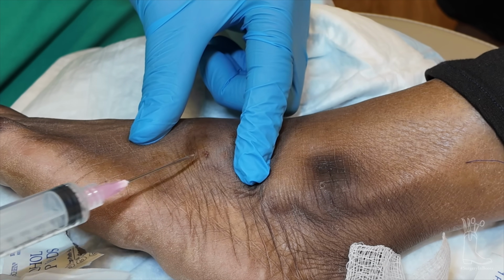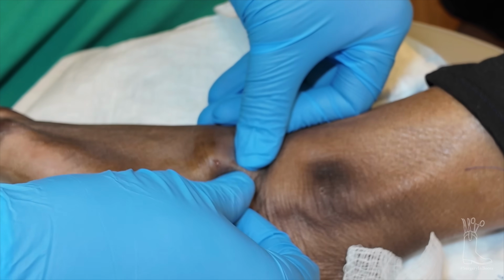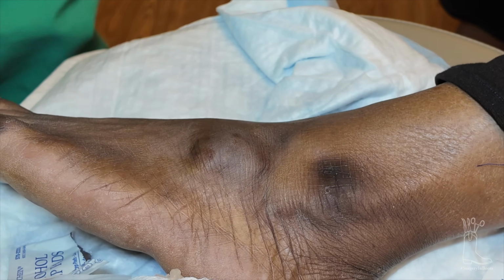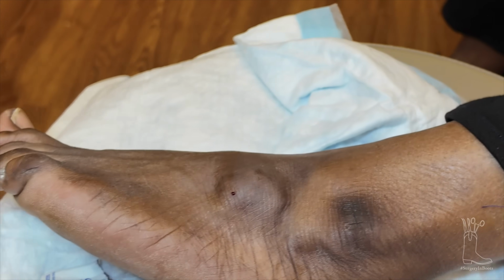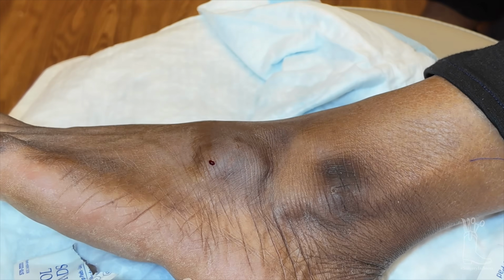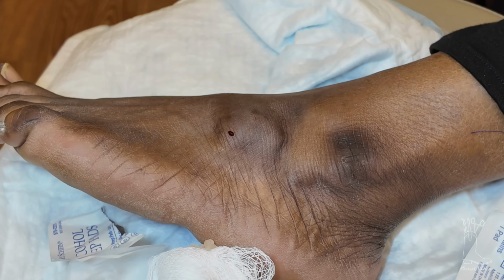Or is it too thick? It's too thick. Oh, let me be quiet because you trying to educate them. No, we educated everybody. You too. Hold on. Let me get a scalpel. Hey, Sally. Let me have 11 blade real quick, please. So we're gonna make a little incision to get all of that out.